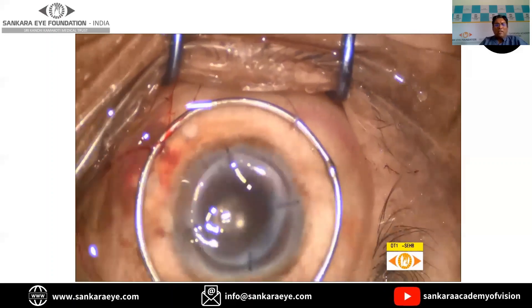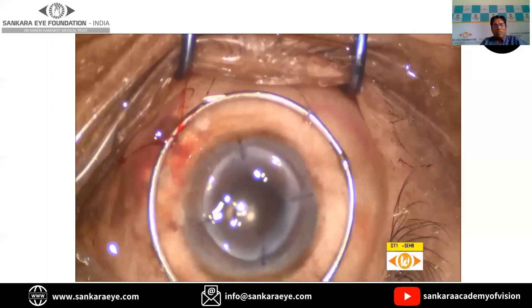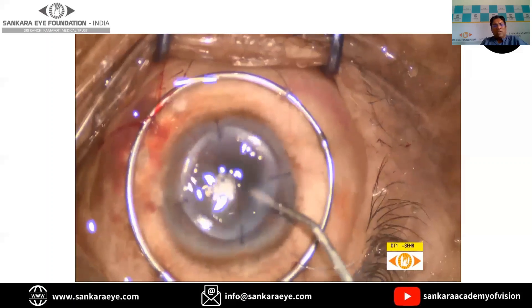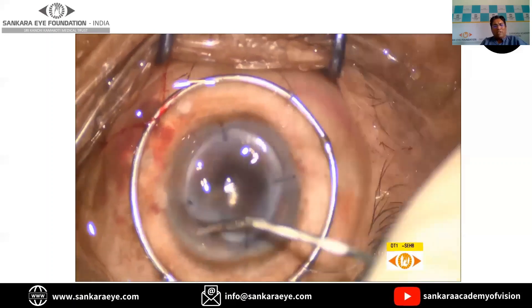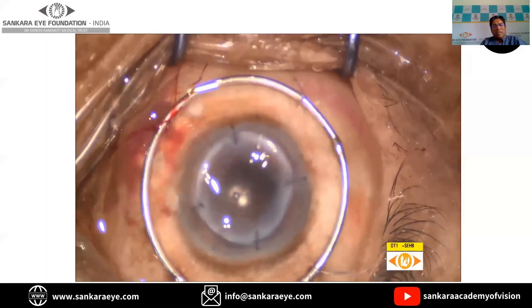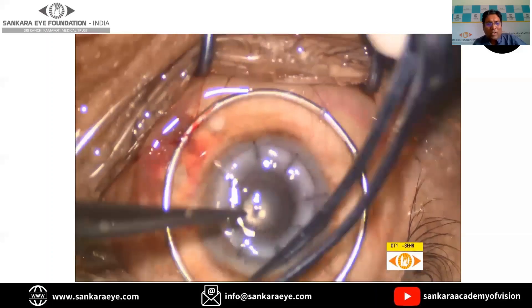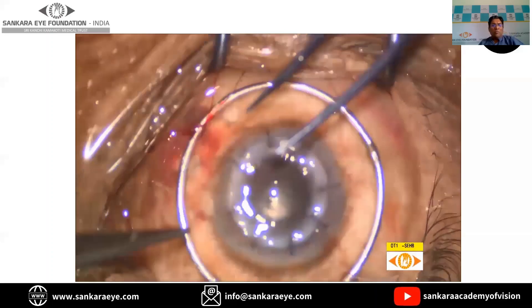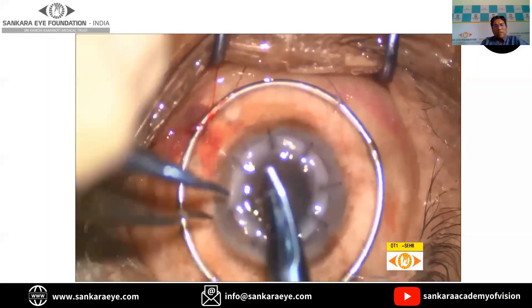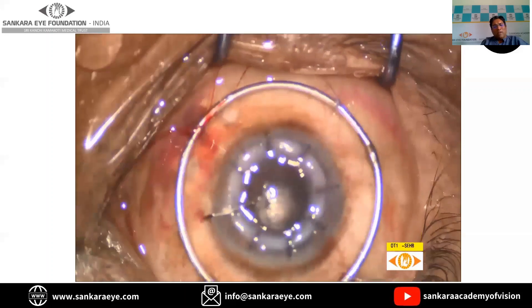Once the four cardinal sutures are placed, we look for the diamond-shaped configuration, following which the other sutures are placed in a radial fashion, totaling 16 in number. Once this is done, the sutures are buried either on the donor side or the recipient side. Most surgeons prefer burying on the donor side to prevent vascularization and thereby reduce the chances of graft rejection.